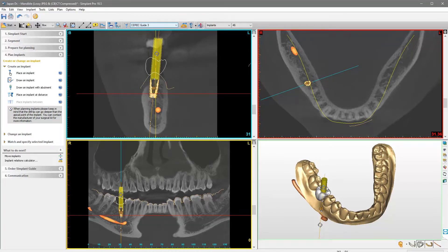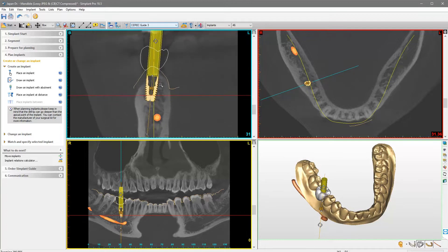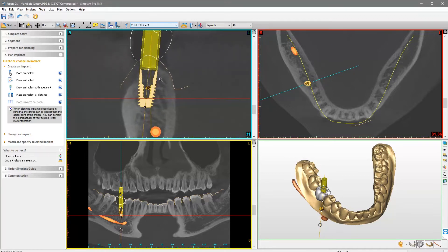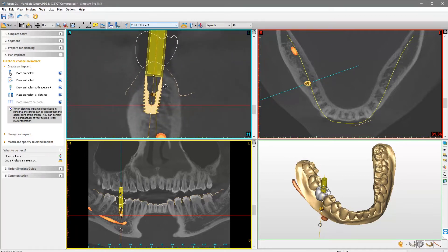You can repeat this process at any moment during the planning to modify the implant details. Now, let us adjust the implant position. We recommend using the 2D views to keep more control over the changes. First, we'll zoom in and center the image.